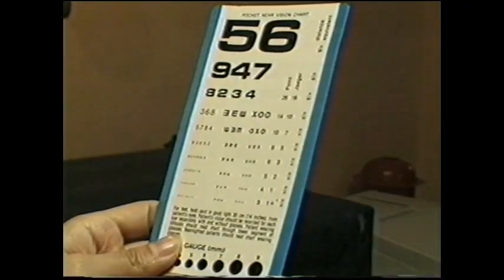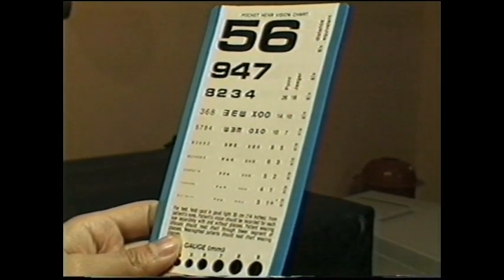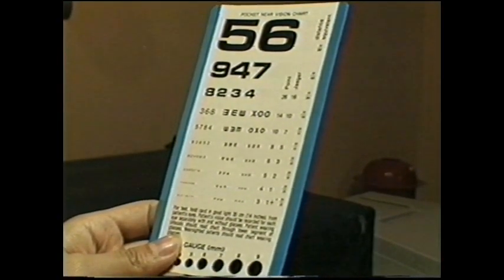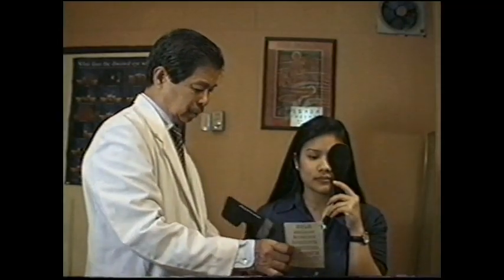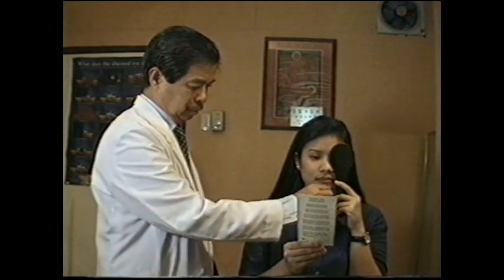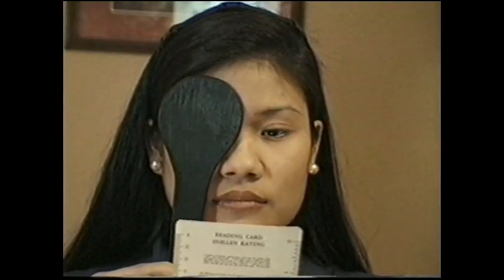Testing near acuity. Number 1. With the patient wearing the habitual corrective lenses for near and the near card evenly illuminated, instruct the patient to hold the test card at the distance specified on the card, usually 14 inches. Number 2. Ask the patient to occlude the eye that is not being tested.